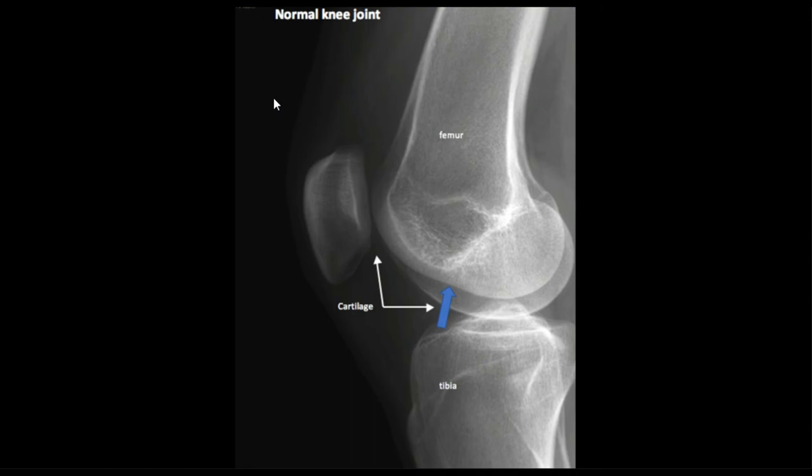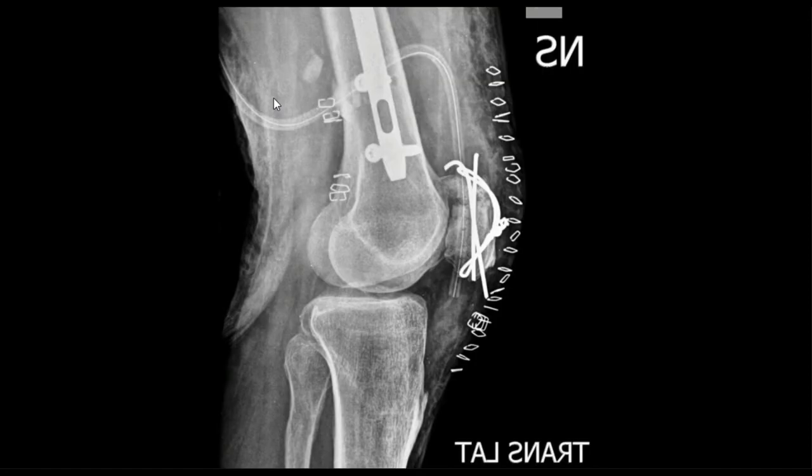Next one. If you guessed laterally rotated, then you are correct. We can clearly see the flatter side is the lateral side, rounder side is the medial side. The position of the fibula helps support this — lateral condyle coming back, lateral side is too far out, and that gives it away. That one's pretty easy.